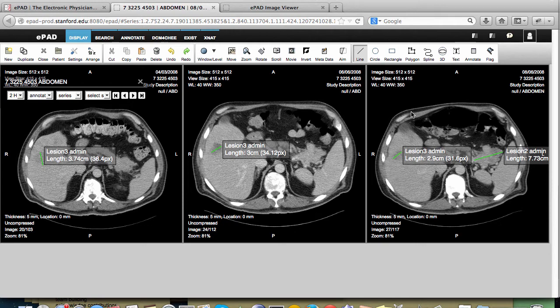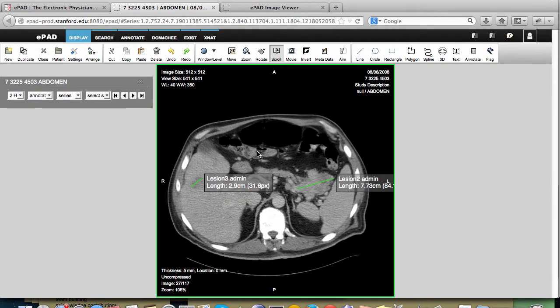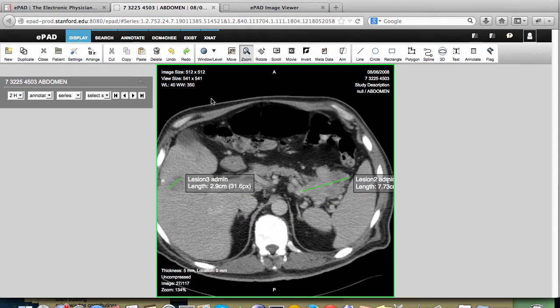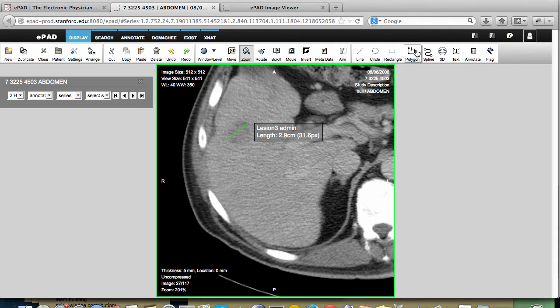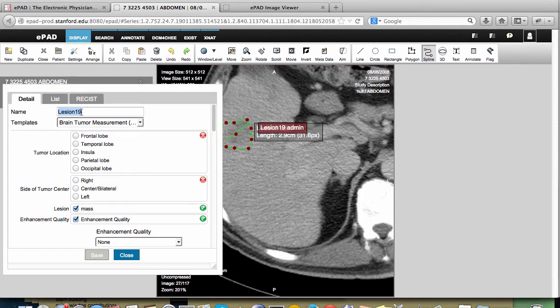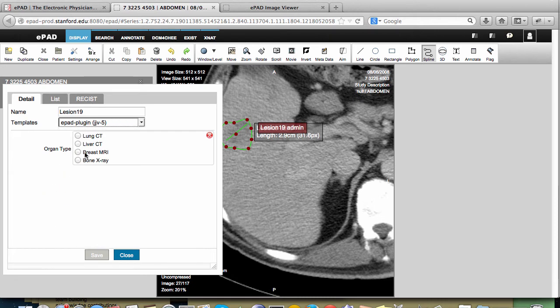Let me show you how to use the feature vector plug-in and look at the results. First I'm going to close a couple of these series, then zoom in on the lesion that I just drew. I'm going to draw a spline around this same area because I want to run my plug-in on this region of interest. In this case I'm going to pick my plug-in template — my feature vector calculation — and say the area is in the liver. Then I'm going to call this plug-in and save it.